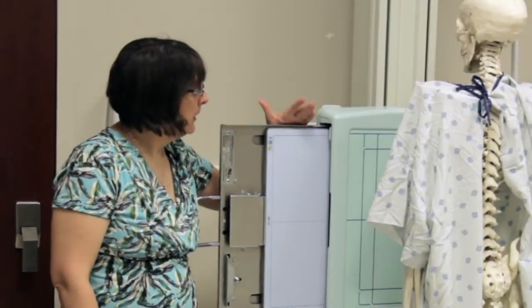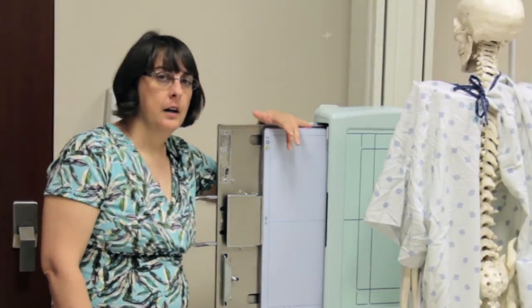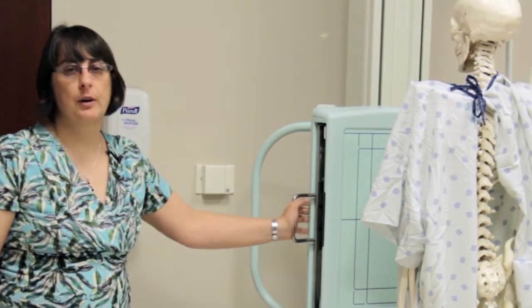For the room setup, for this particular patient, I'm going to stitch with my detector in the lengthwise position. It is possible to do it either way — lengthwise or crosswise. So if you have a wider patient and you're trying to include ribs, crosswise might be the way to do that.